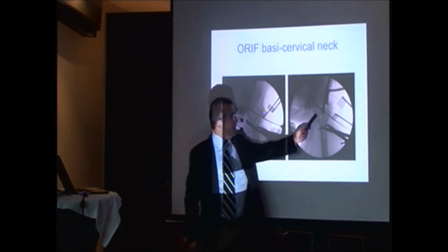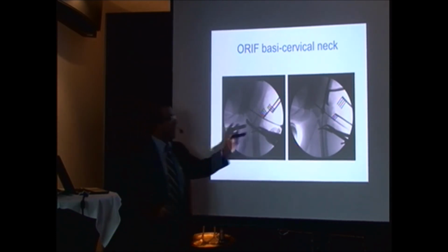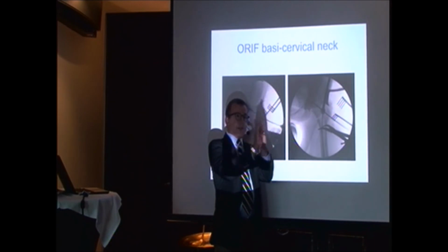This is something I do that we published. Whenever you have a fracture that comes out of the greater trochanteric area, when you do normal reaming, the reamer is going to be lateralized. You're going to preferentially ream the lateral part of the proximal femur. So when you put your nail down, what's going to happen is it's going to push this part, which hasn't reamed, and it's going to separate them.